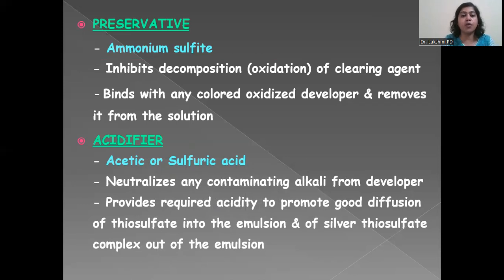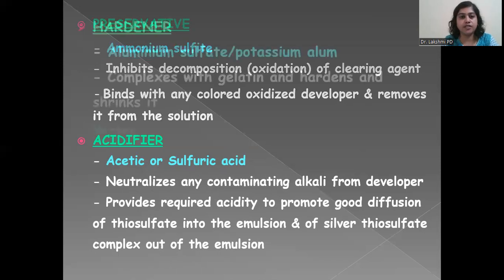And not only that, it promotes your acidic medium, which will help in apt action of your ammonium thiosulfate, and it will also help in good diffusion of your ammonium thiosulfate into the emulsion of the film. Also, I told you earlier, the unexposed silver crystals are dissolved into soluble thiosulfate complexes, and this dissolution back into the solution is aided by the acidifier of your fixer solution.